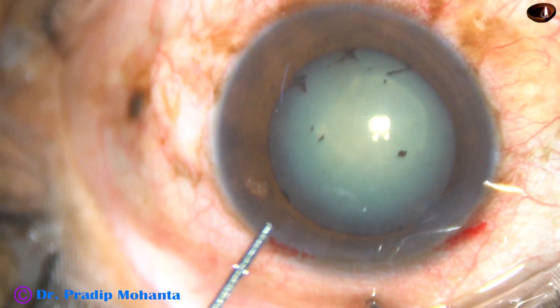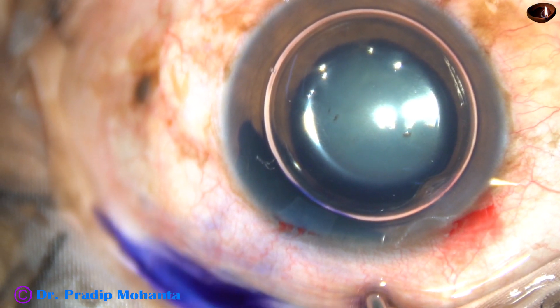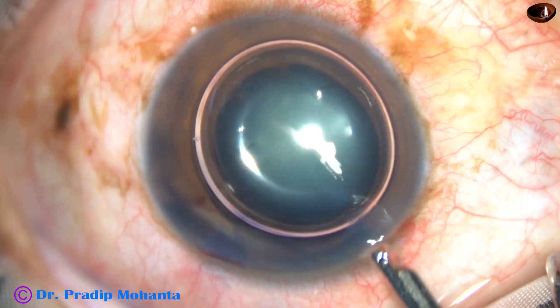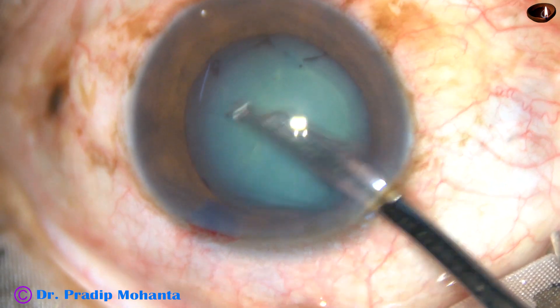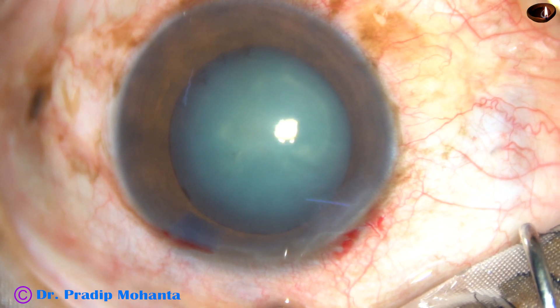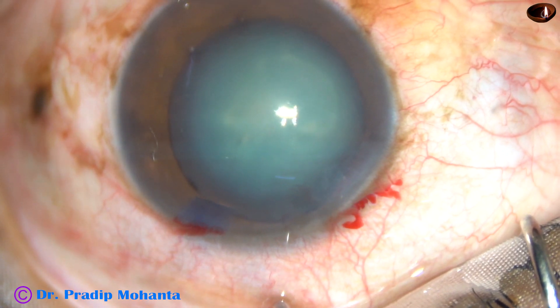By this time, the main incision and a side port on the left side of the main incision have been made. Now I am going to stain the anterior capsule with trypan blue dye. The pupil has not dilated well, but it is adequate. However, adrenaline may help, so I have applied a few drops of adrenaline. Now the dye and the adrenaline are washed out. Yes, the pupil has dilated a little more. And now the anterior chamber is being filled with 2% hydroxypropyl methylcellulose.